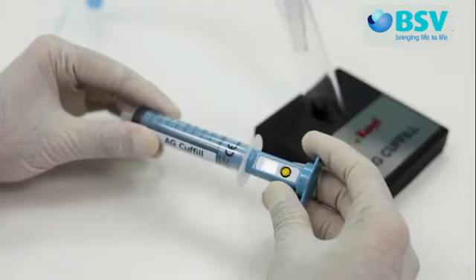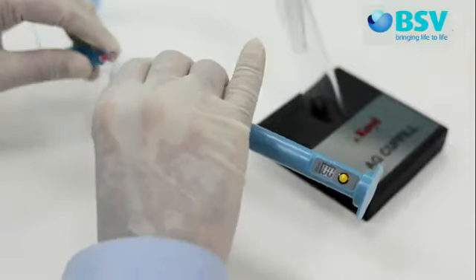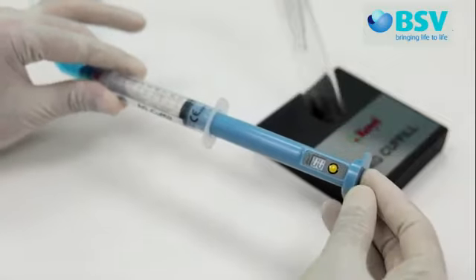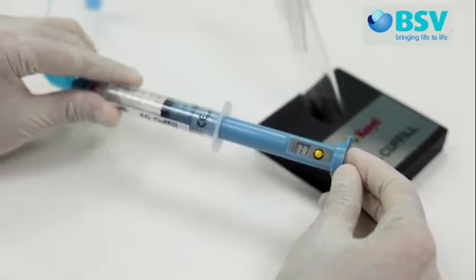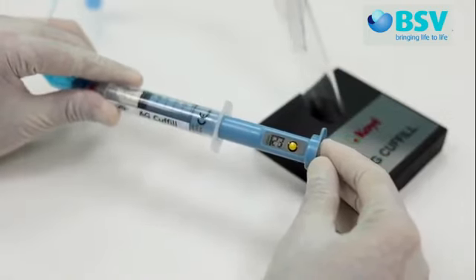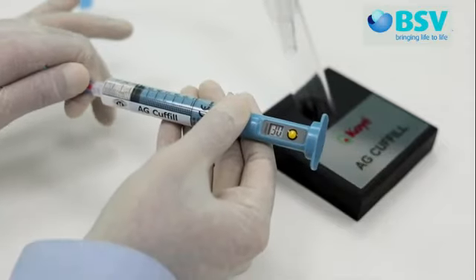To inflate the ET cuff, pull back the plunger, connect to the pilot tube, and push the plunger in to inflate the endotracheal cuff. As you inflate, you can see the pressure reading on the LCD. Once you achieve the desired pressure, stop inflating and disconnect from the pilot tube.